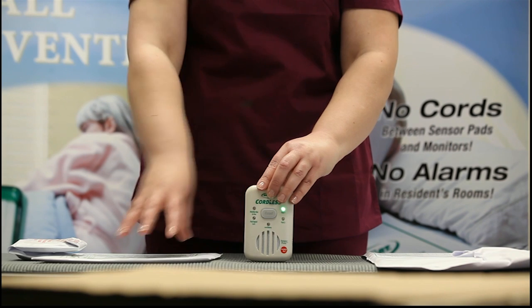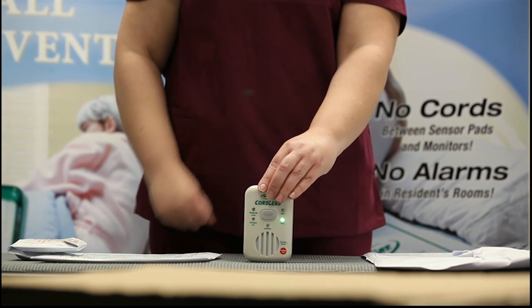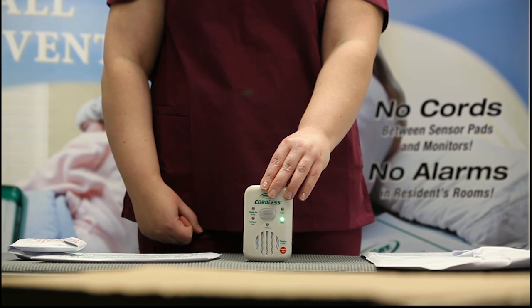Press on the first pad and release. If you have a floor mat, turn the transmitter on. The monitor will beep twice and the light will transfer to pad two.